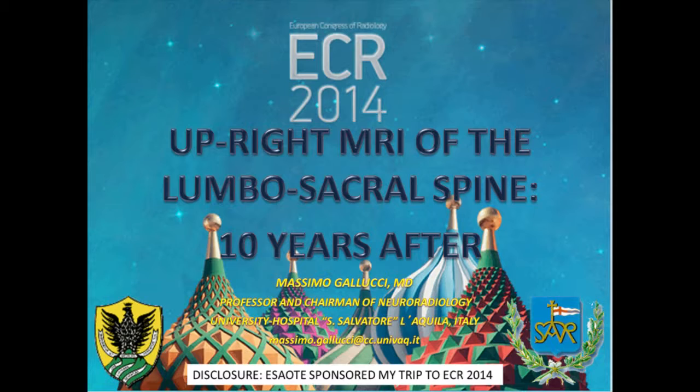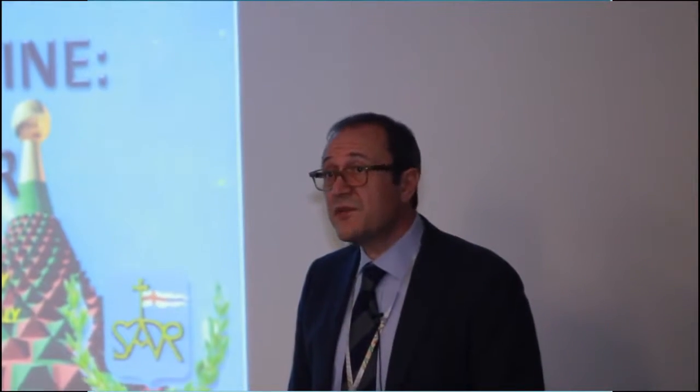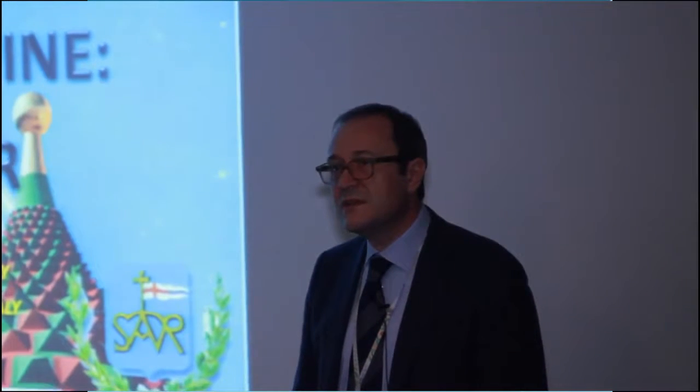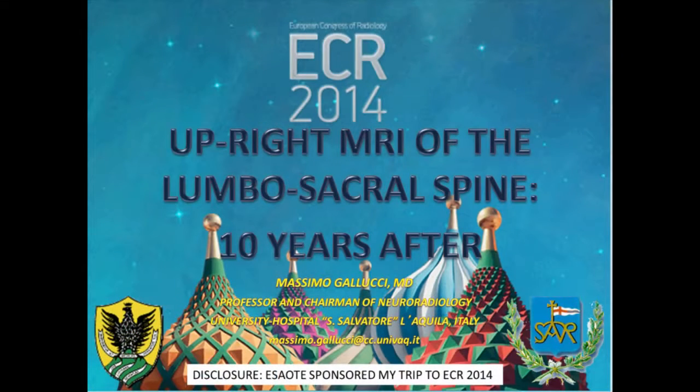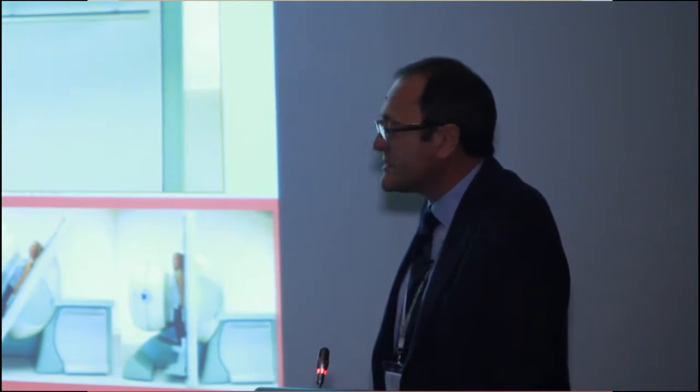Since we started our adventure with Salvatore something like 30 years ago, because we started with the first Italian machine, 0.5 Tesla. It was in '86, and it was a nice pioneering adventure. And after that period, we also had the opportunity to start 10 years ago, in early 2004, with this device we already discussed today, and we are still discussing.